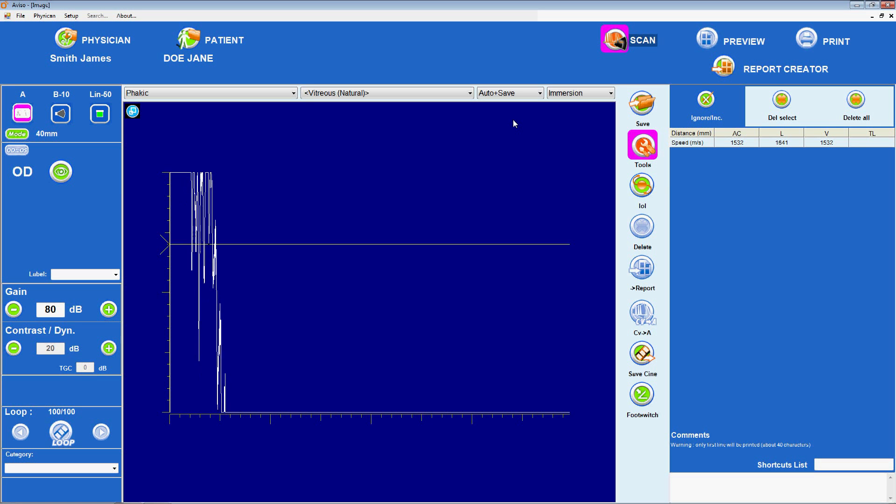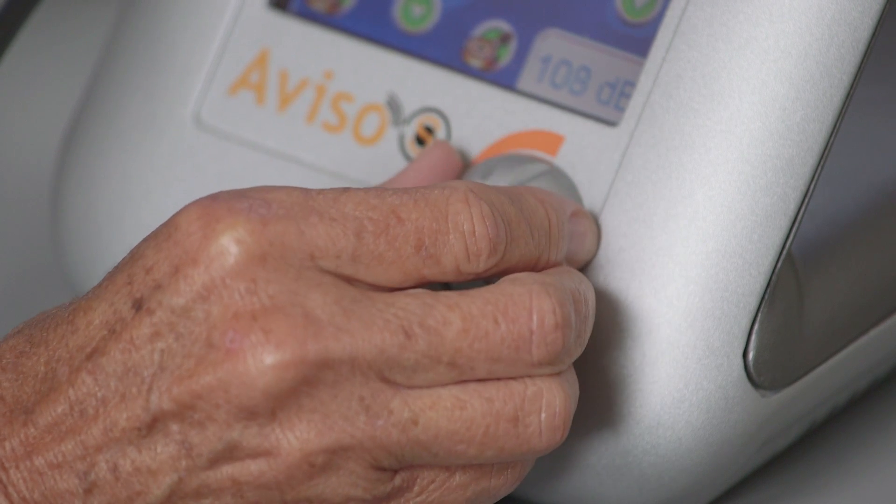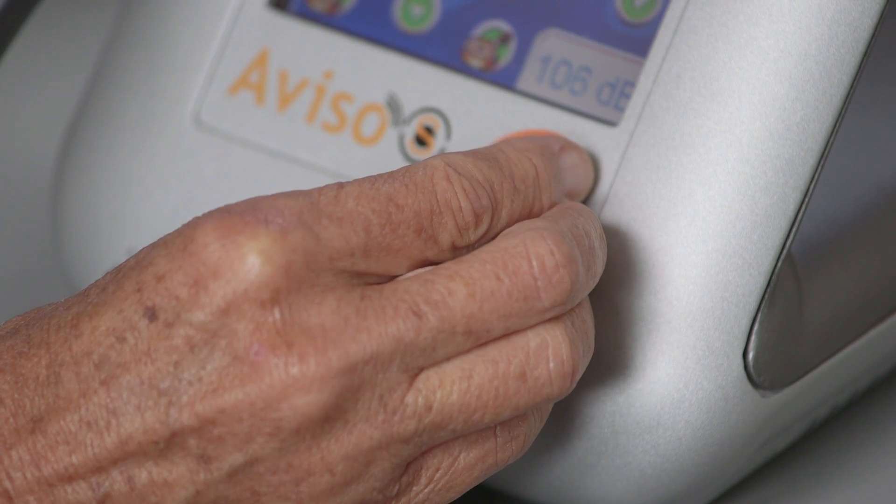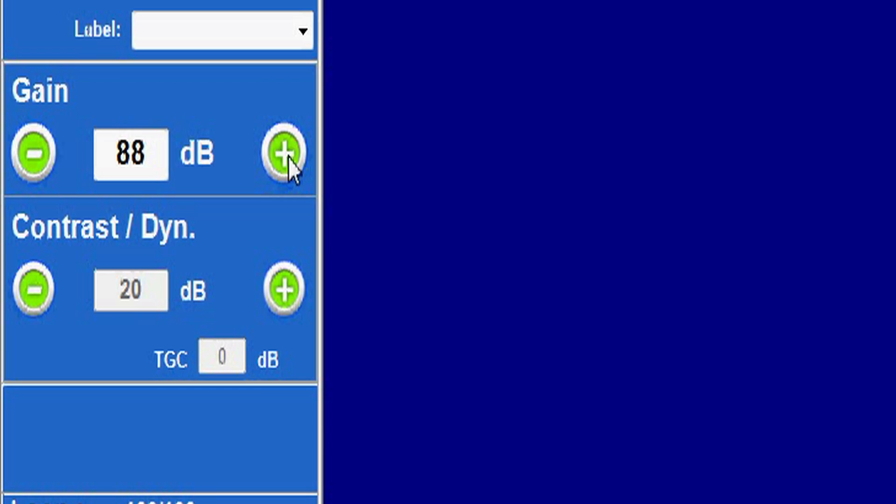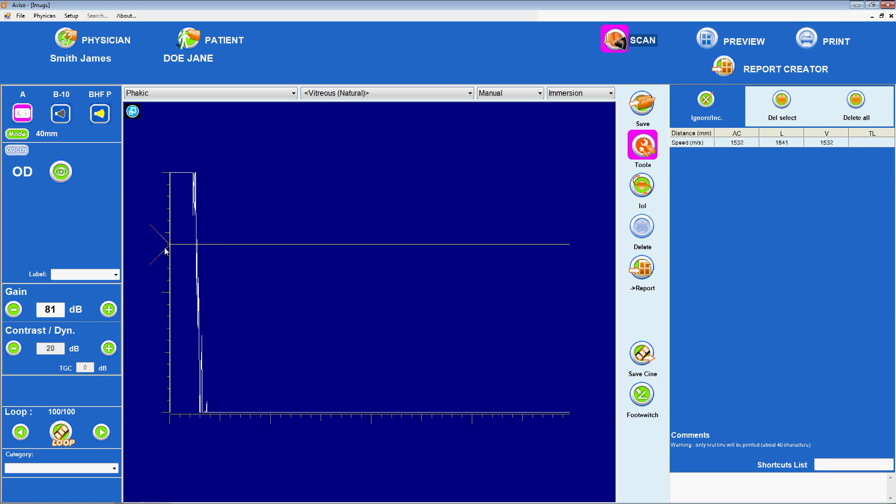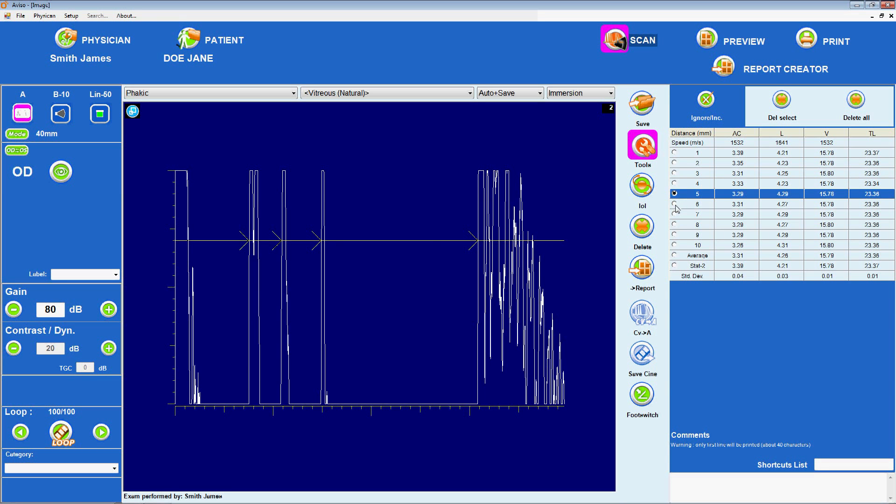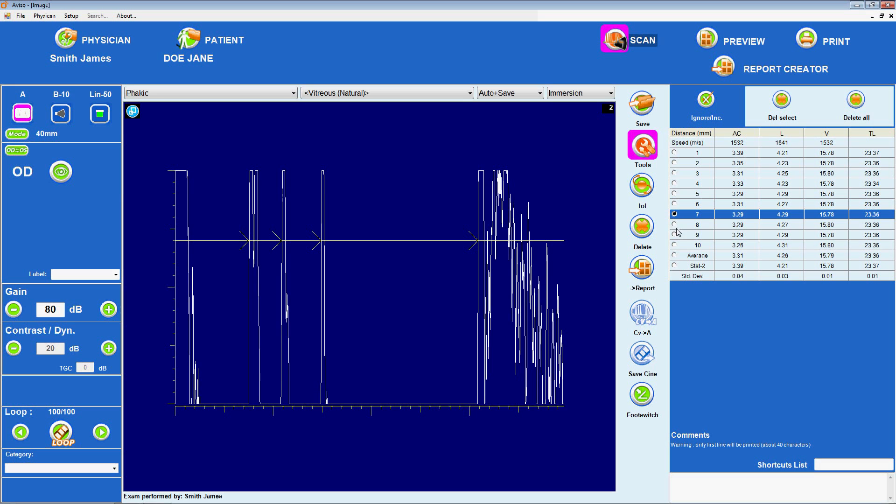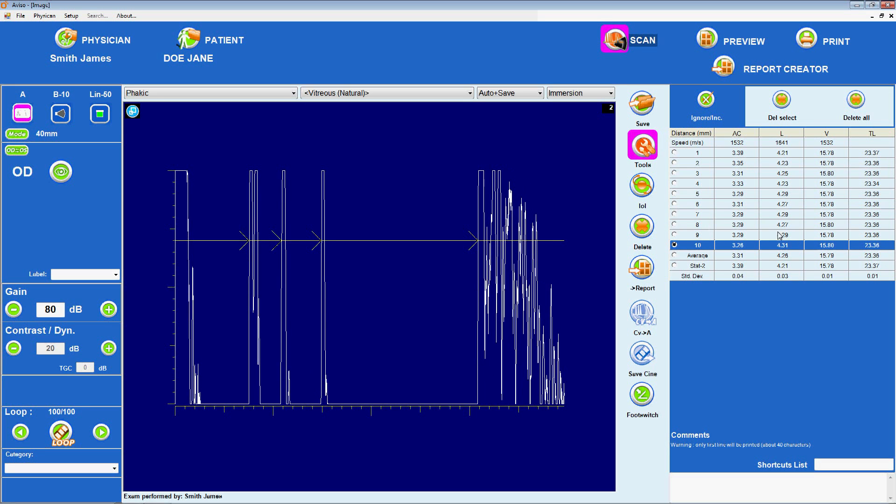The examiner can adjust the gain and dynamic by turning the gray knob at the front of the Aviso unit, or by clicking the plus and minus signs in the gain field on the left side of the screen. A measuring cursor can be positioned manually for more precise or additional measurements beyond what is captured in automatic mode. The software also allows the examiner to review the scans obtained in automatic mode and delete any outliers or suspect results.